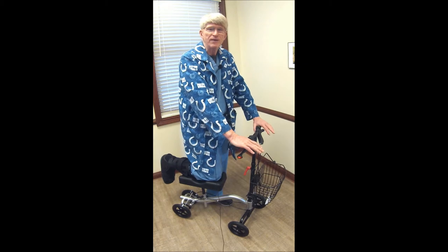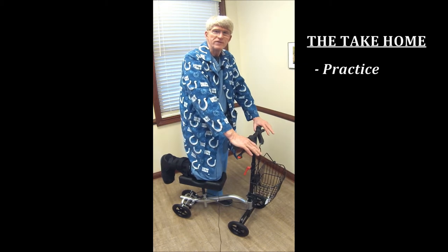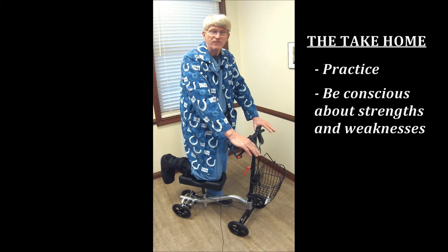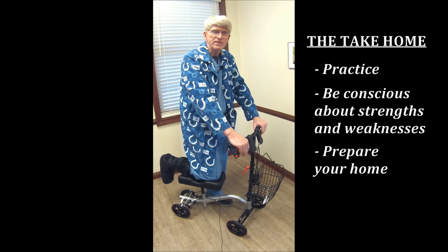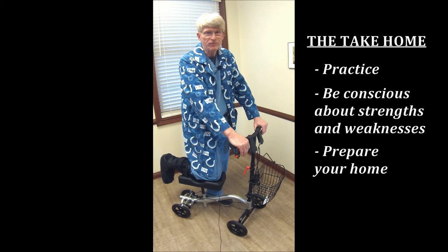So regardless of which option you choose, you want to have early skills and early strength — practice these way before you need to. If you know you're going to have surgery, start working on your arm strength if you're going to use crutches or a walker. Practice with this, and prepare your home. Watch out for loose carpets and door jambs — those can all be problems. And just keep in mind, especially when you go out, you will be a bull in a china shop.